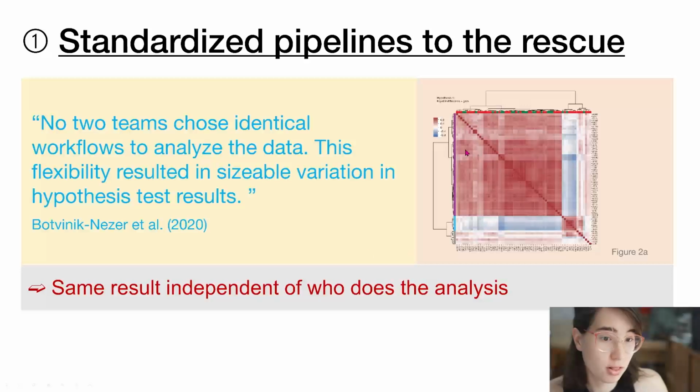So they were all different, mostly similar. And this is a problem for science, right? We need to have consistent results. And so if everyone was using standardized pipelines, then there would be so much less difference. We would get the same results no matter who sets it up, because most of the crucial choices that can affect outputs have already been made in the pipeline.